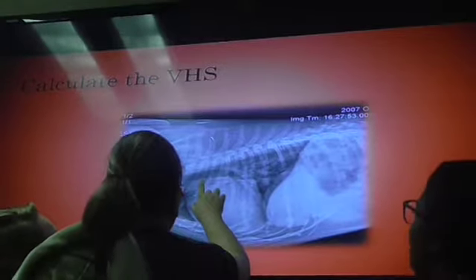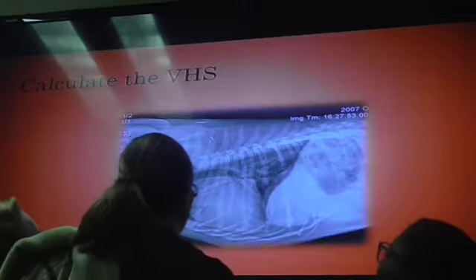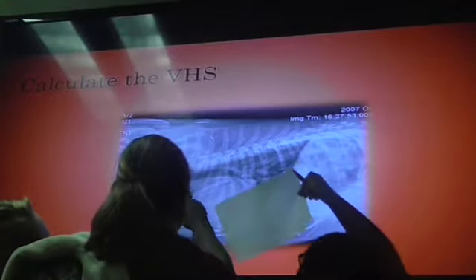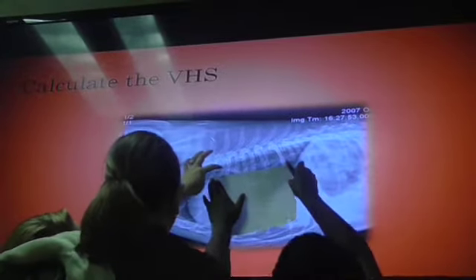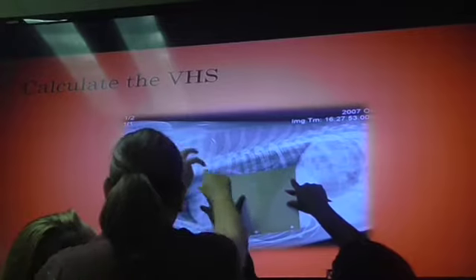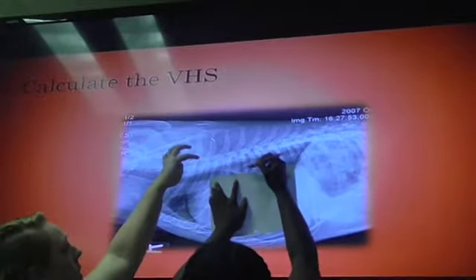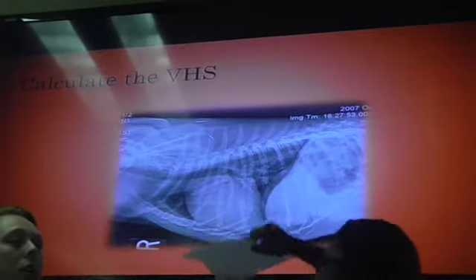Remember the spaces of each other. The spaces are a little bigger just because, remember, if you want to count, you go to T4 to do the whole measurement for the long axis. You start at the carina and at the apex. For the width, you start and then you end at the ribs. But even the ones that are on the other side?